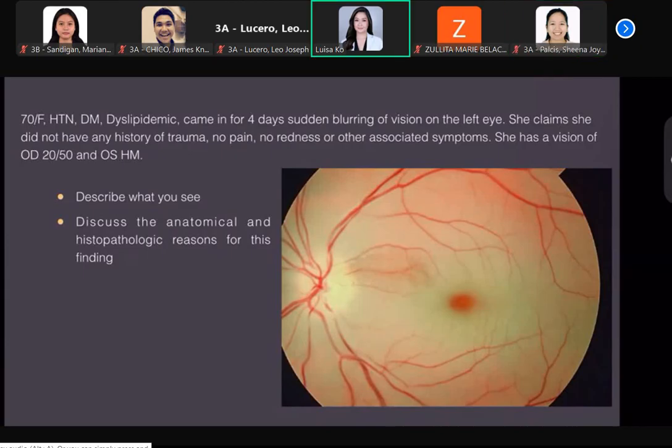Okay, so what happens if it's ischemic and edematous? Retinal whitening, Doc. Good. So you see the background choroidal flush that is preserved against a background of white edematous retina. So that's why it looks red.